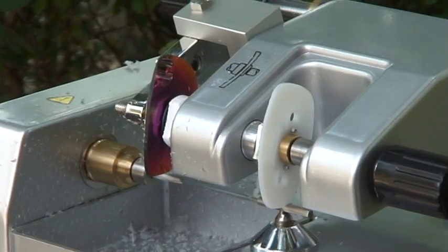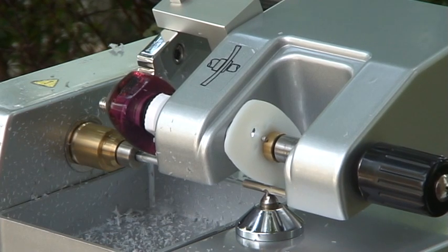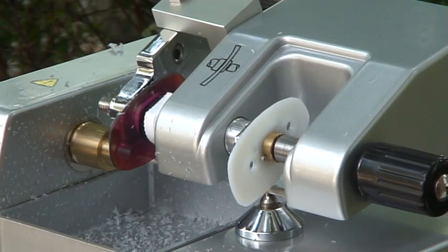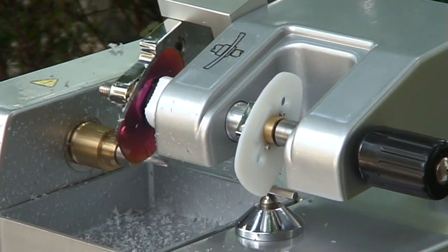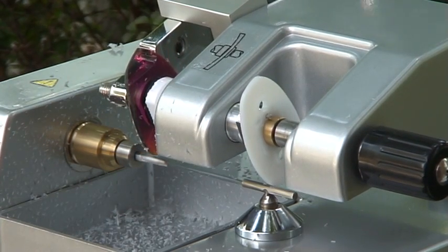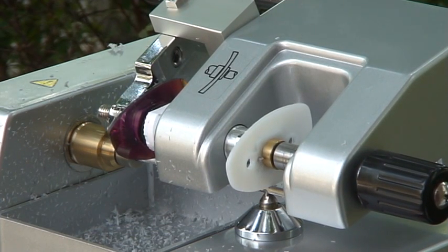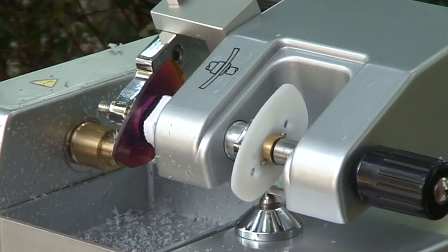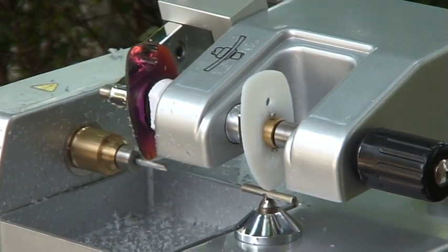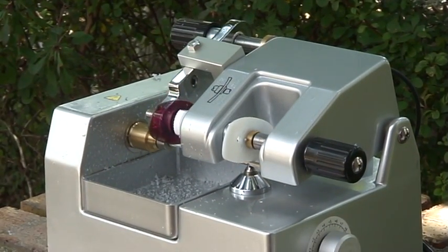So it looks like we're about done over here. We'll let it make one or two more passes. And of course, beveling that lens would be an extra step. What you wind up with is a flat surface all the way around the outside of the lens, so beveling would be something you would have to do by hand or buy a beveling wheel to go along with that. But it looks like we're about done there. So we'll pop it off and we'll see what we got.